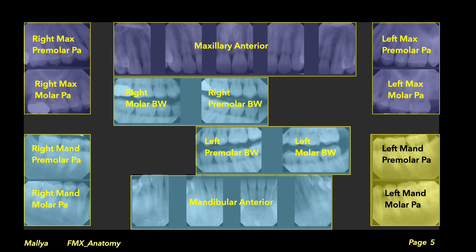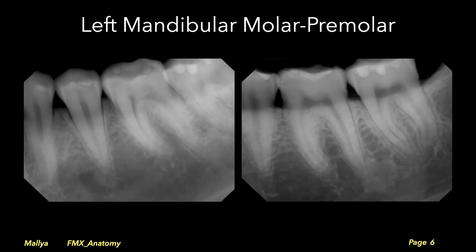We next move on to the mandible, starting with the left mandibular posterior region. These radiographs should show the mandibular premolars and molars. Note that the mesial aspect of the first premolar is not seen; however, the premolar bitewing does adequately demonstrate this region and no retake of this radiograph is required.